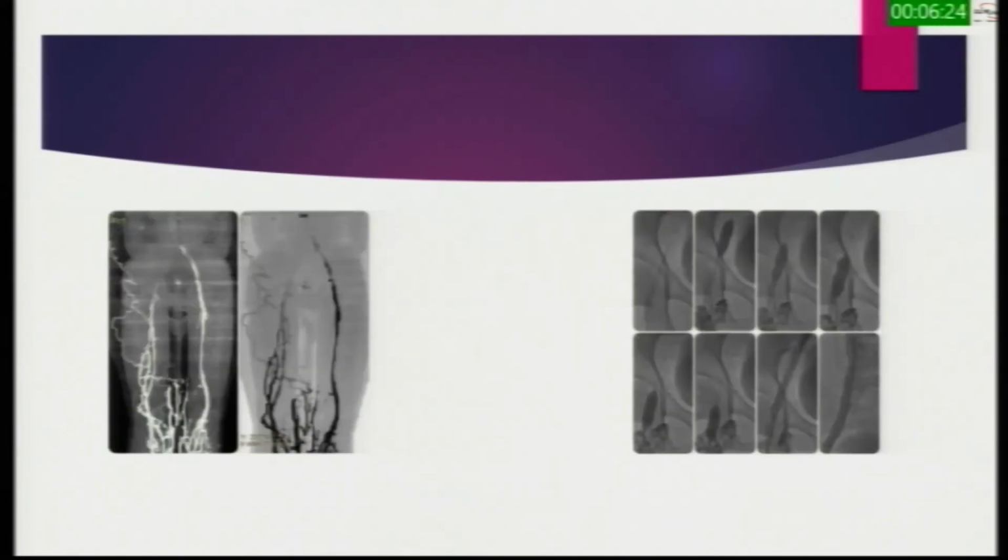This picture shows the venography pre-op and post-op. We see here an occlusion in the right iliofemoral segment. I don't have a pointer, I'm sorry, but we can see the balloon. After the balloon, we see the dilatation. After that, we stent, then do post-stent deployment venography. We have a completely open iliofemoral segment.